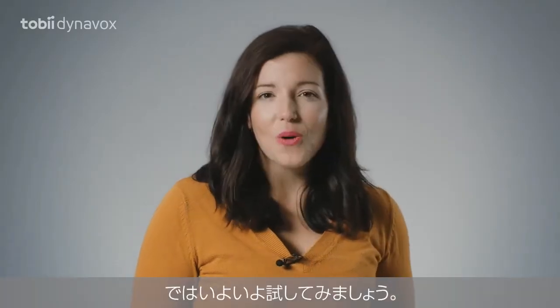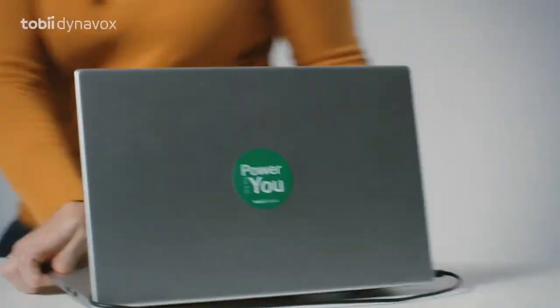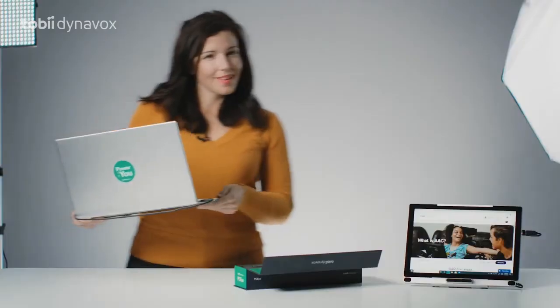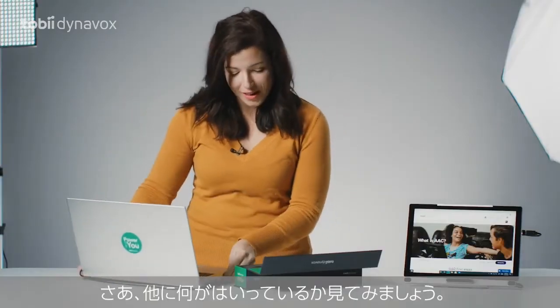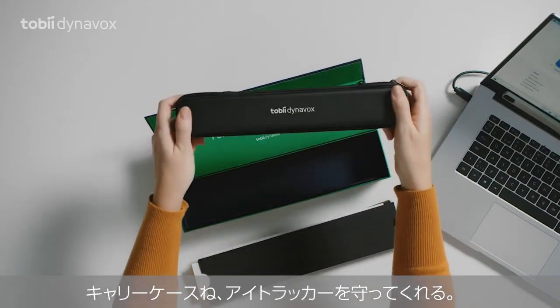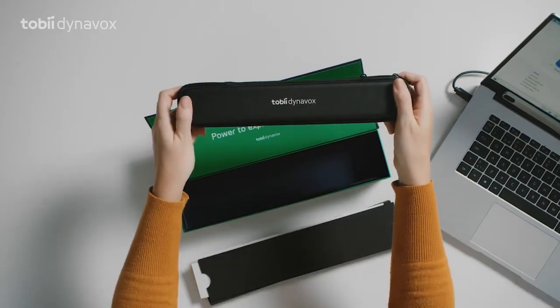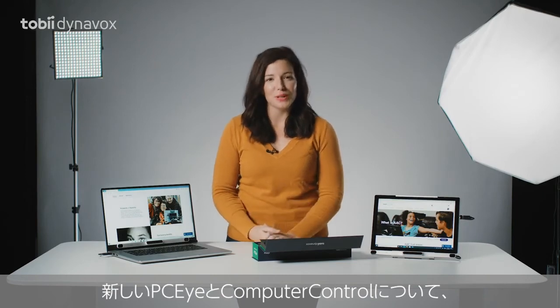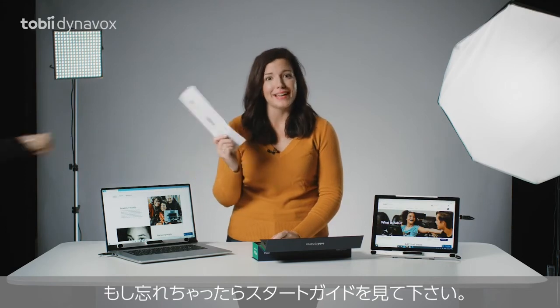And now it's time to put it to the test. I knew it — it works great in sunlight. Now let's see what else is in the box: a carrying case, great for protecting your eye tracker. And that's about it. The new PCI with computer control. And if you forget all of this, just refer to your getting started guide.